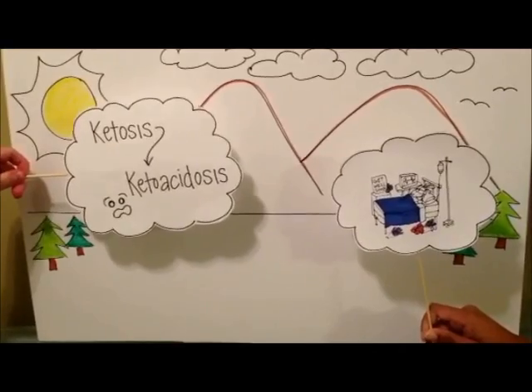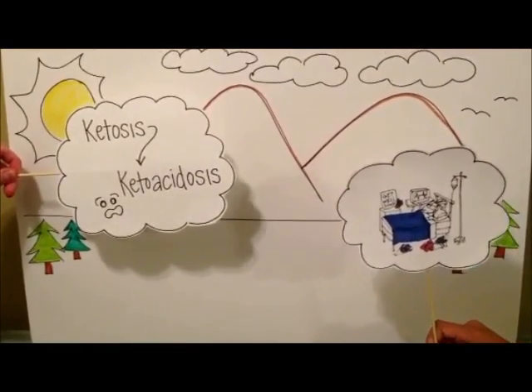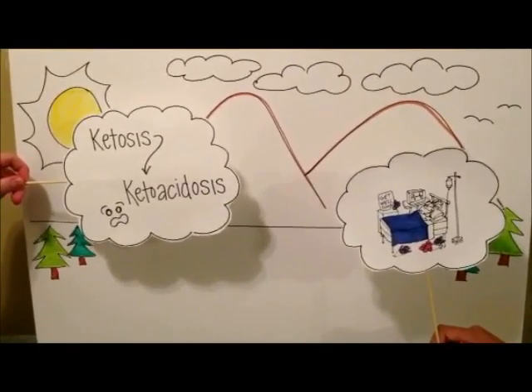When high levels of ketones are seen in diabetic patients, immediate actions need to be taken. Contact your doctor as soon as possible so that they can help determine what medication changes or regimens need to be made.